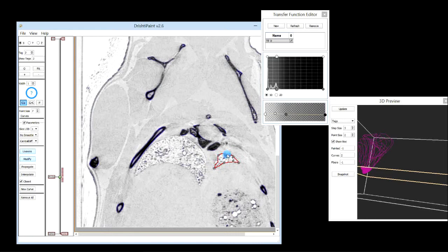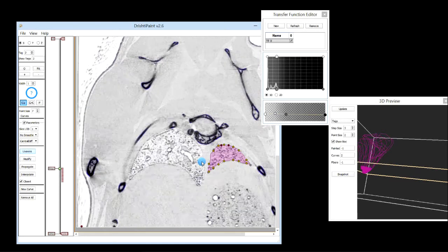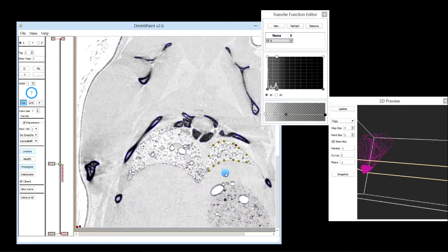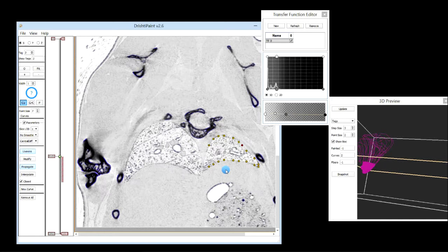What we have done now is use the curves from another, orthogonal slice to generate our guess points for this curve. And now similarly we can use this curve here, press spacebar and then propagate upwards or backwards in this case. And again you can press spacebar to stop the propagation process.